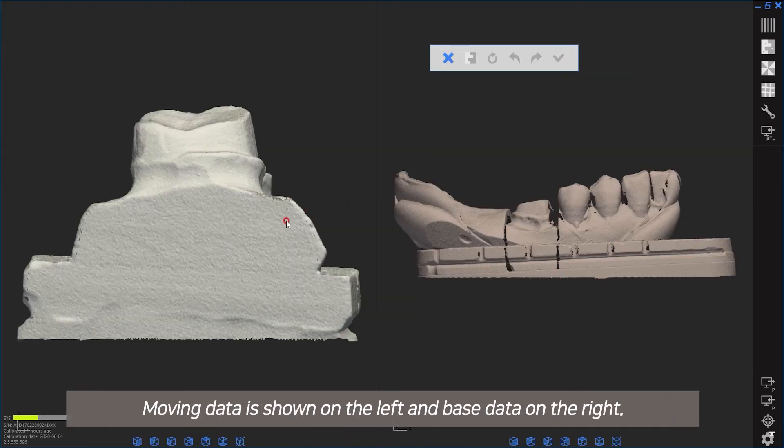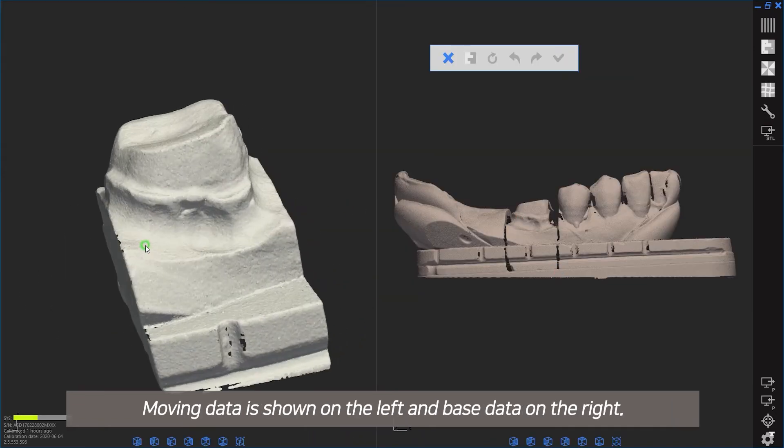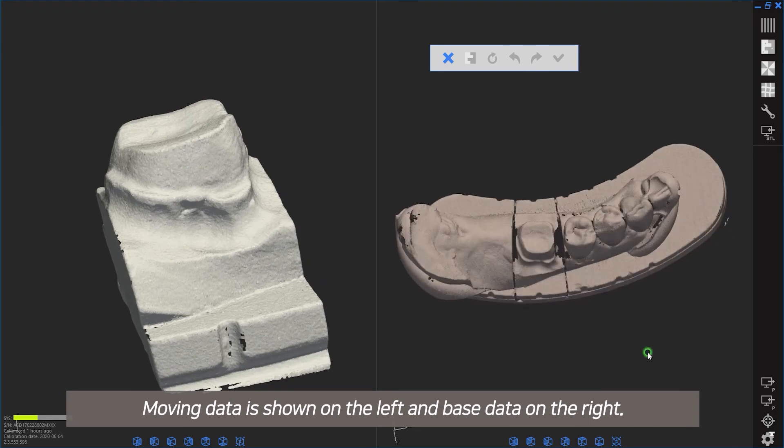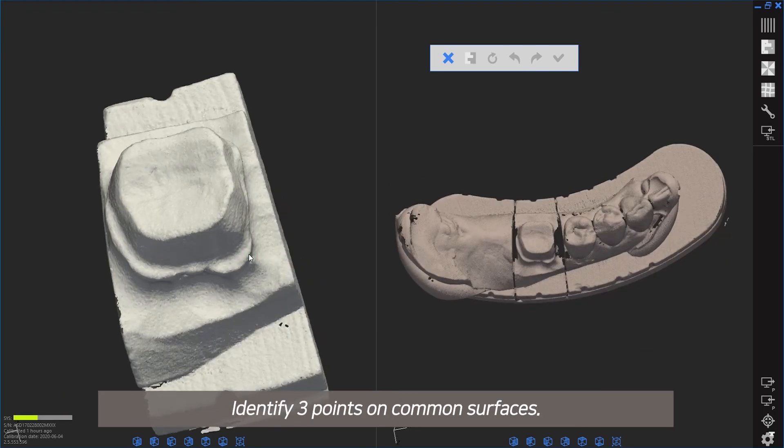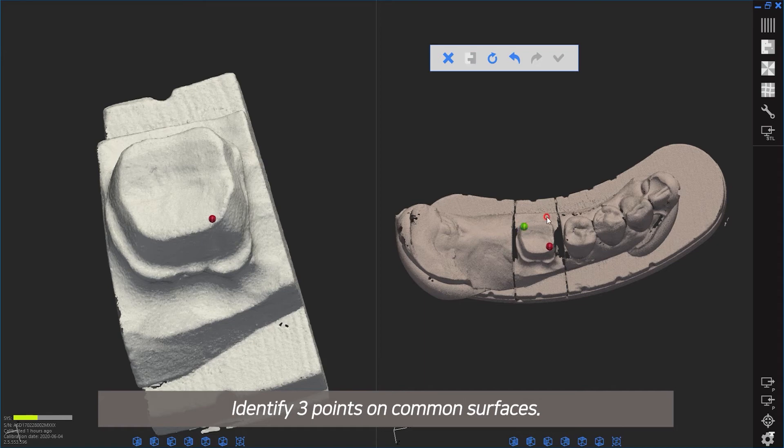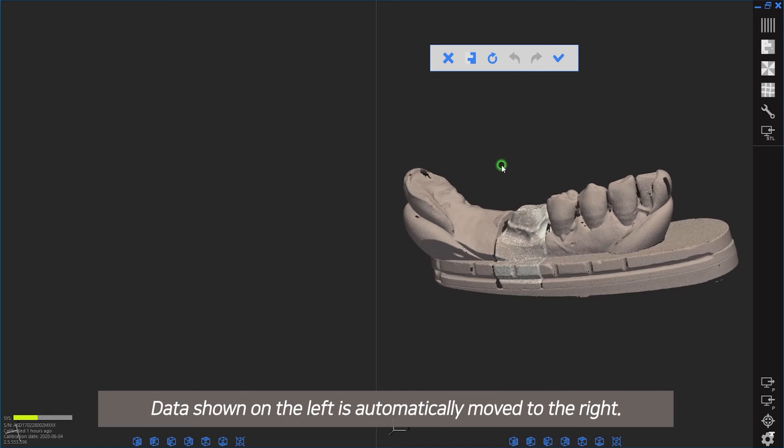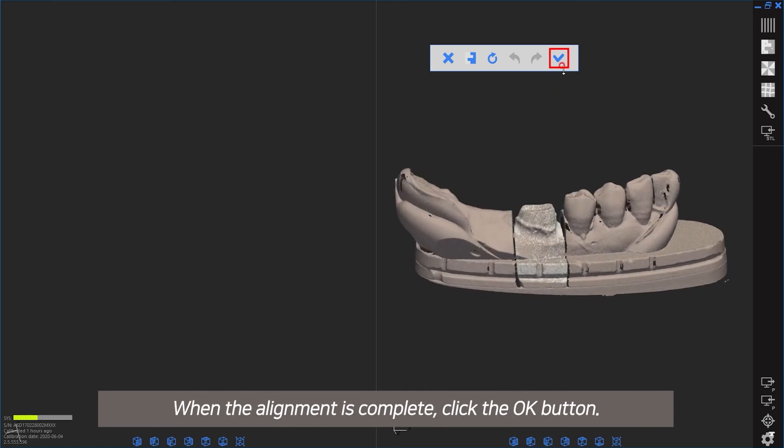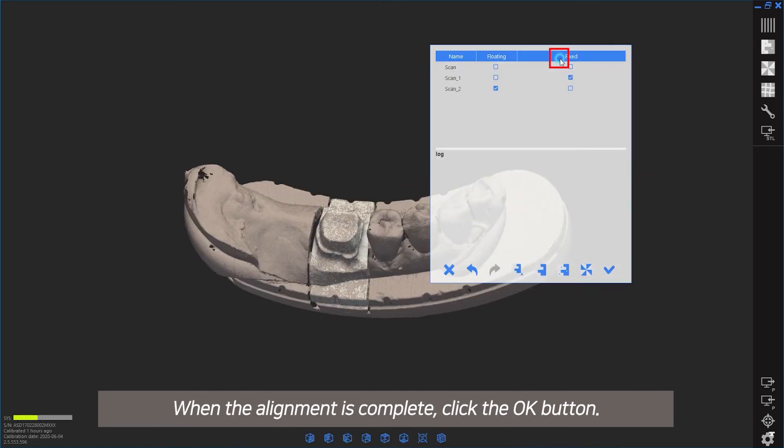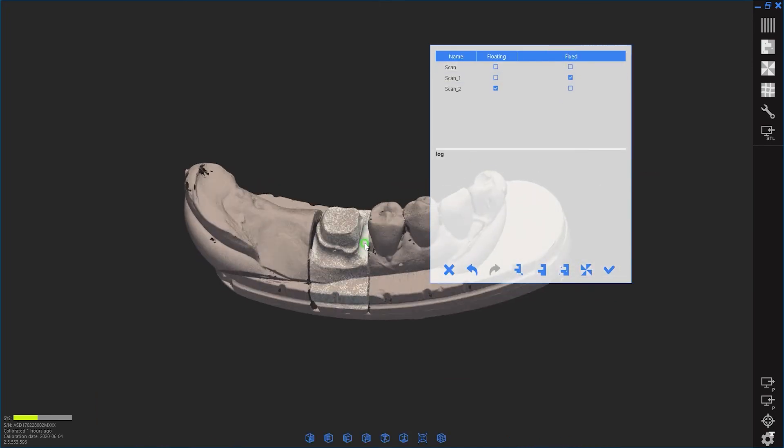Moving data is shown on the left and base data on the right. Identify three points on common surfaces. Data shown on the left is automatically moved to the right. When alignment is complete, click the OK button.